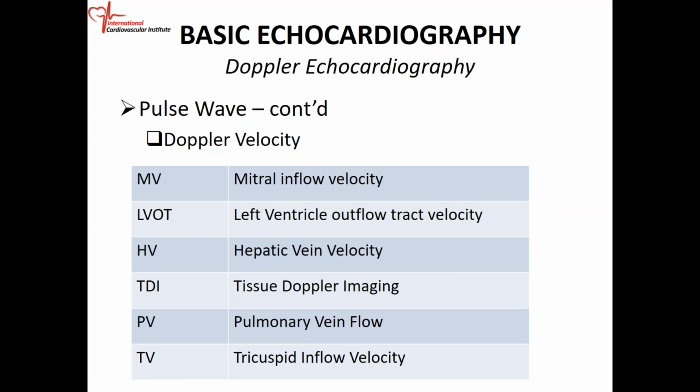So anywhere you have motion, any type of movement, Doppler can assess that movement. That's all we're doing. We're just using our Doppler to assess movement of, say, blood across a structure, or the movement of tissue. Very important. If the velocity is a slow one, we can use pulse wave Doppler. Remember that color flow Doppler is a form of pulse wave Doppler.